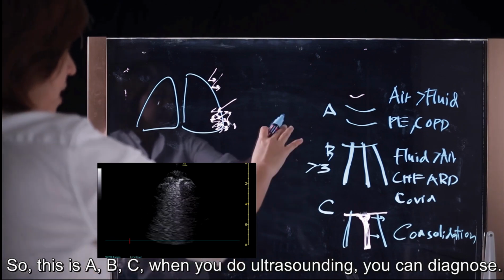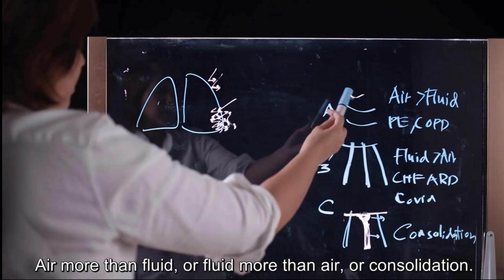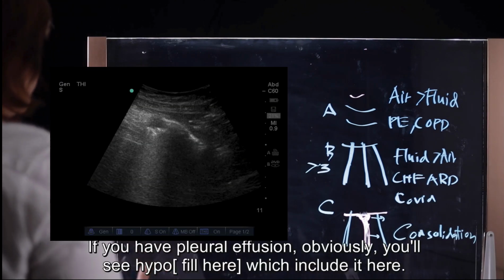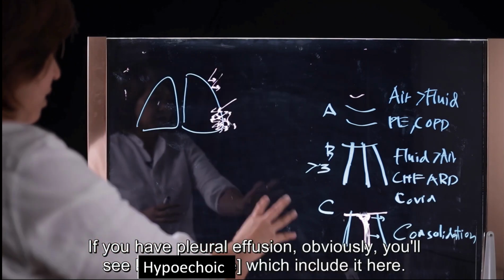So this is A, B, C. When you ultrasound, you can diagnose whether you have more air than fluid, more fluid than air, or consolidation. If you have pleural effusion, obviously you see hypoechoic, which we didn't include here.